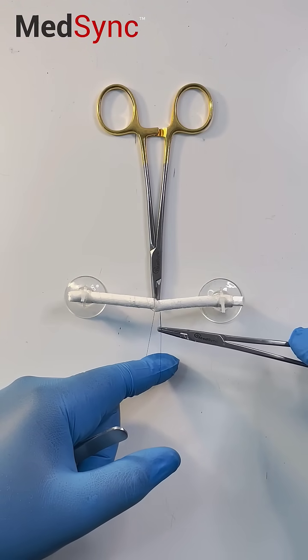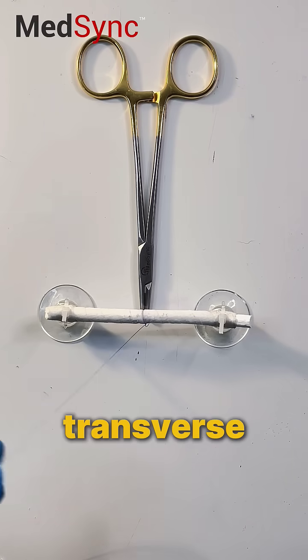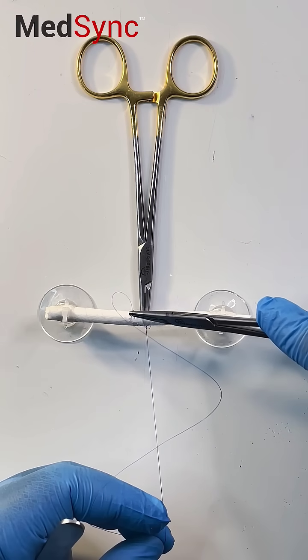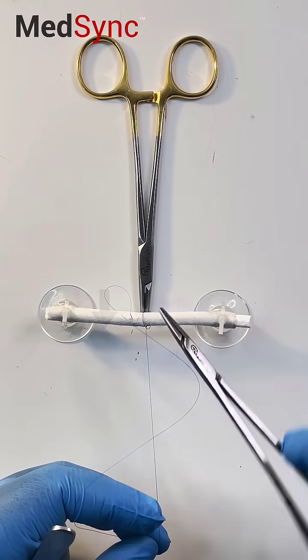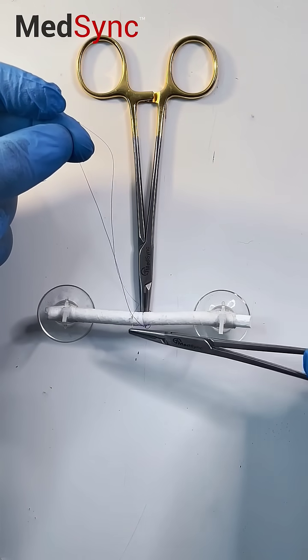You didn't see how we started, but we're going to show you how to do it. You simply take transverse bites opposite to the direction of travel. I'm suturing towards me, therefore I'm traveling this way. Let me show you what I mean.